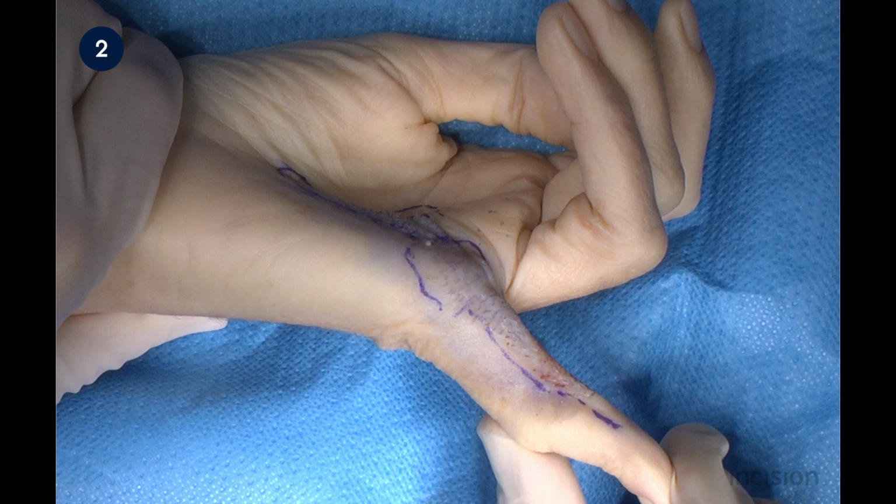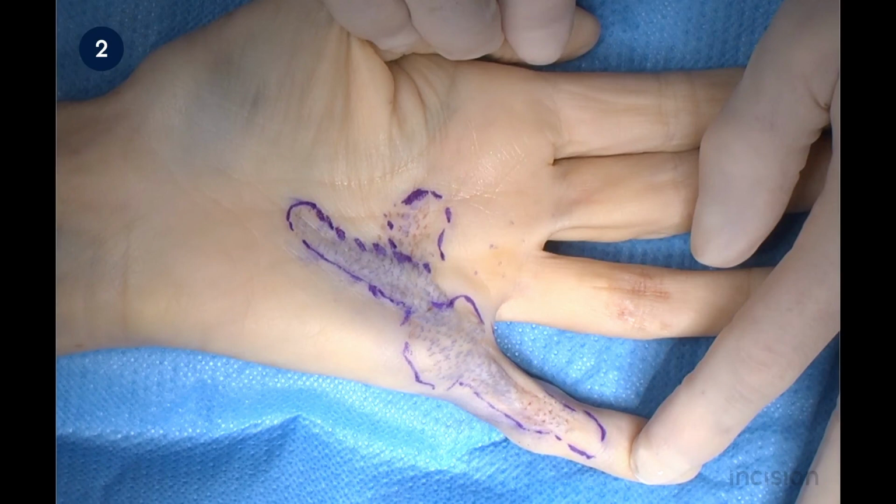In this case, the surgeon applied a cast postoperatively for 1 week to passively extend the finger, as this patient had a contracture for almost 5 years. This is done in order to disrupt the memory of the contracted position of the joints. Whether or not this is done depends on local postoperative care protocol and the preference of the surgeon.